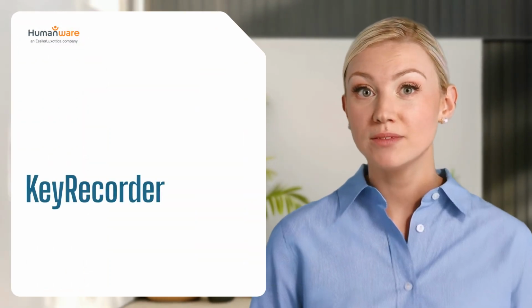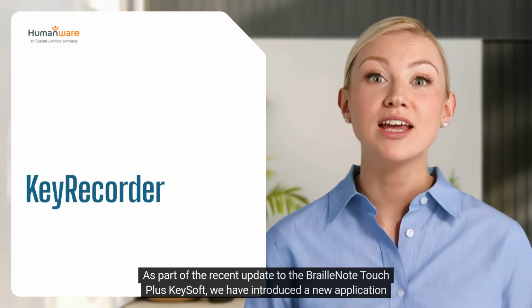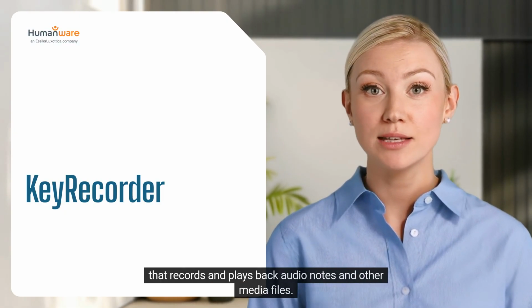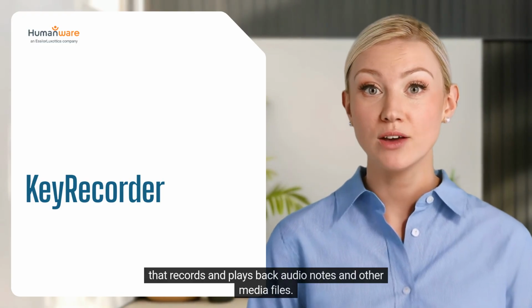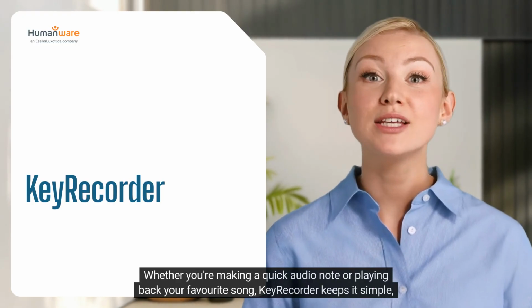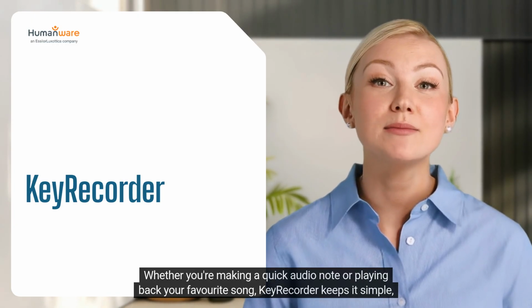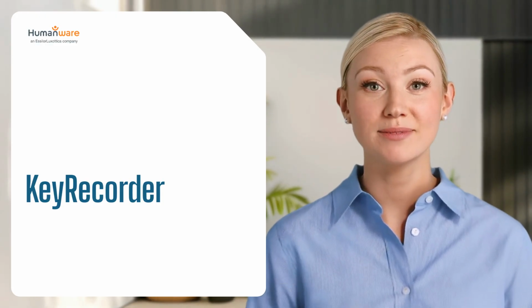Hello and welcome! As part of the recent update to the Braille Note Touch Plus KeySoft, we have introduced a new application that records and plays back audio notes and other media files. Whether you're making a quick audio note or playing back your favorite song, KeyRecorder keeps it simple, fast, and accessible.